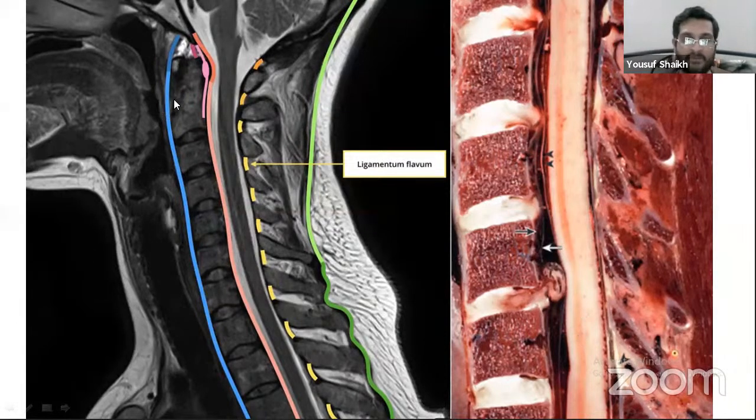On the sagittal MRI, we can also appreciate, and as I mentioned previously, that whenever we're doing an anterior approach, anterior discectomy, after removing the disc, the PLL, if it is significantly thickened or causing pressure, has to be removed as well in order to completely free the dura.